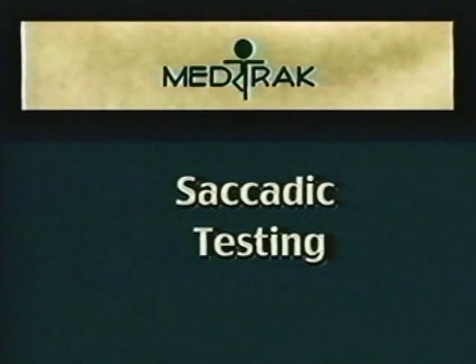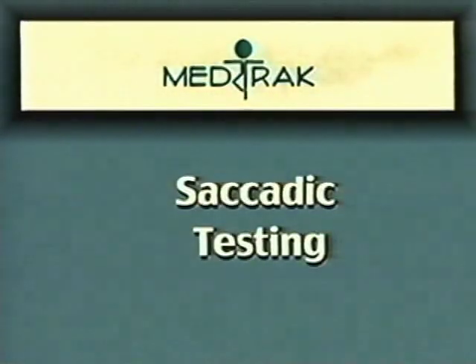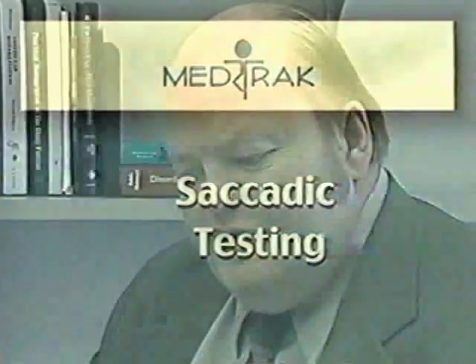The next portion of the oculomotor battery is the saccadic testing. Saccades are dependent upon the evaluation of rapid, accurate refixation movements with the eyes. They may be voluntary or reflexive, and they are typically used for tracking large, quickly moving, repetitive images.